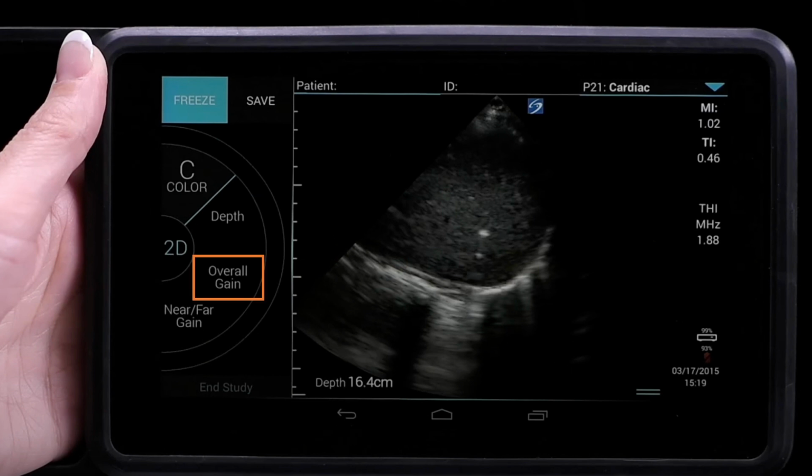And finally, gain. So gain has a little bit to do with contrast and the power of the signal. It's one of those things, again, you've got to get your hands on to really understand it. But if I were to turn the gain up a lot, what I'd be trying to do is maybe see something on the screen that's not very visible, and I want to turn up the gain to brighten it up and be able to see it. Now, the downside of that is I lose my contrast. Suddenly, everything becomes very bright and hard to see. On the other end, if I turn my gain way lower, everything becomes darker and I lose my contrast. So there is a benefit to changing the gain, but do know that you can go too far with it. And on the machines, there's usually a button to reset the gain. So if you've gone too far in either direction, you can reset it.